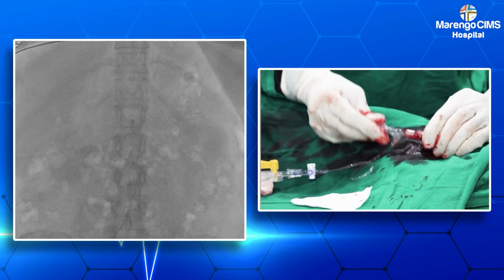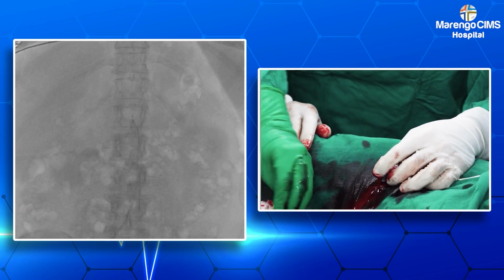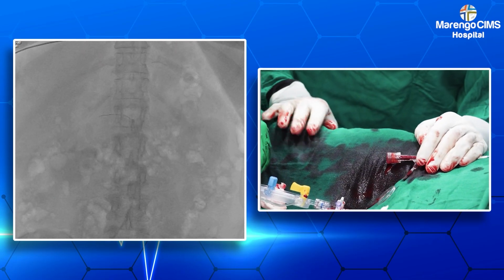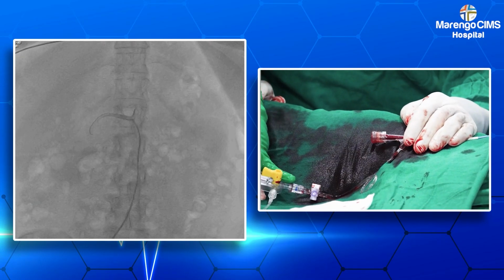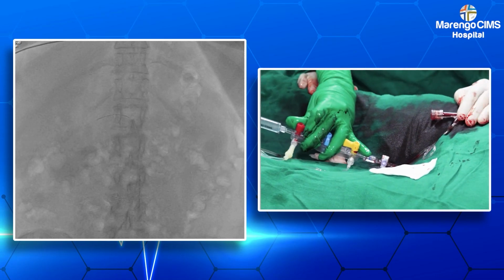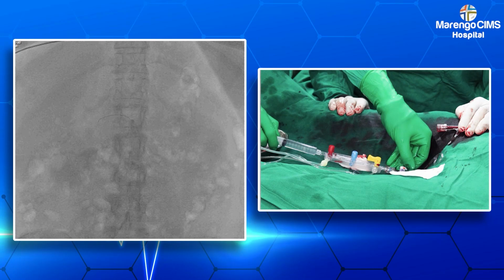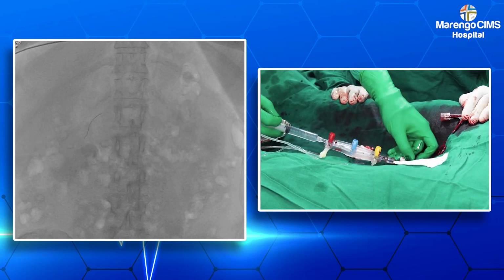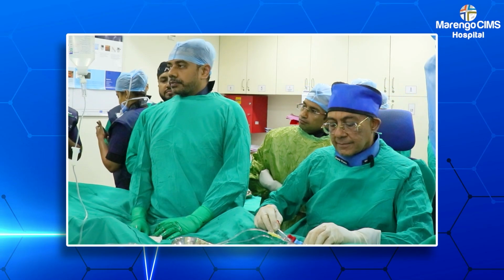Her present blood pressure right now, with last medication taken last night, all 6 medication yesterday, is about 220 this morning. We have not given her morning medications just to ensure that during the procedure she doesn't get hypotensive due to sedation. The intra-aortic pressure right now is 216 by 86. Mean pressure is close to 120.